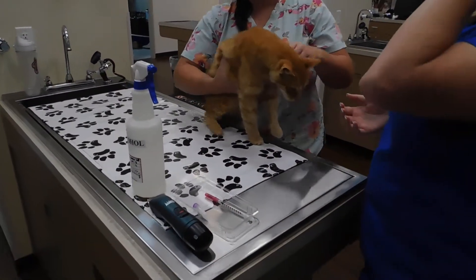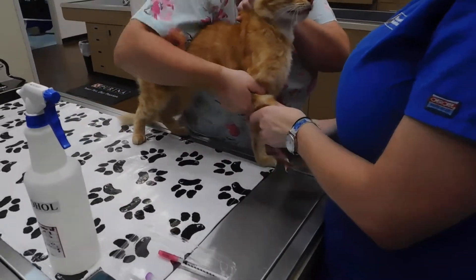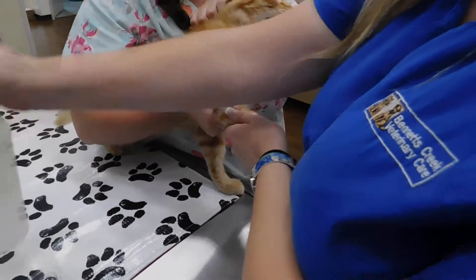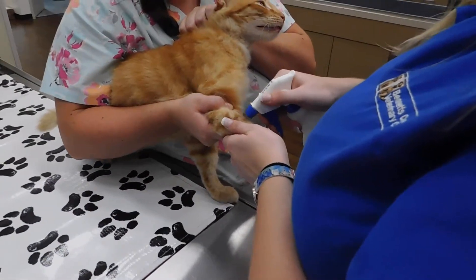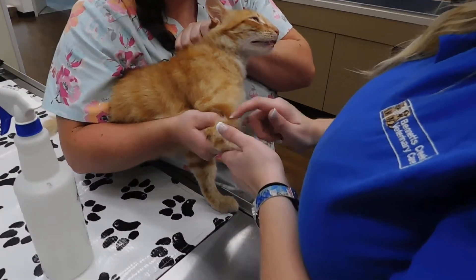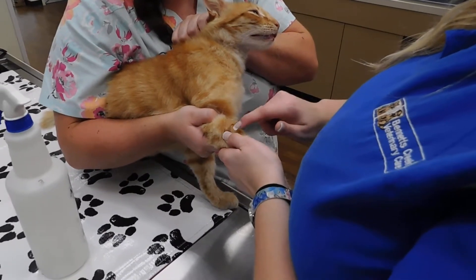The assistant is going to go ahead and restrain the patient and hold off the vein, keeping this arm extended for me. I'm just going to spray the alcohol. I can feel the vein, and I'm going to use my thumb to just stabilize the vein here.